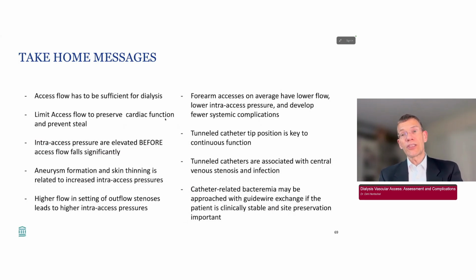Tunneled catheter tip position is key to function, and you want to do a check on the chest x-ray to see that the tip is in the right position.